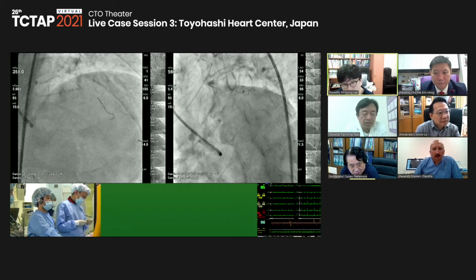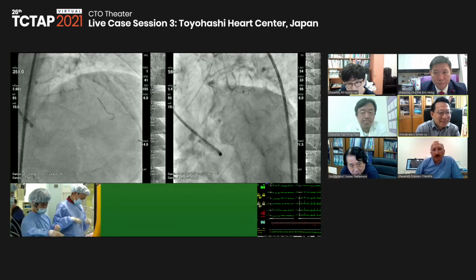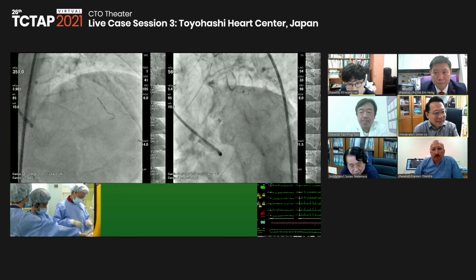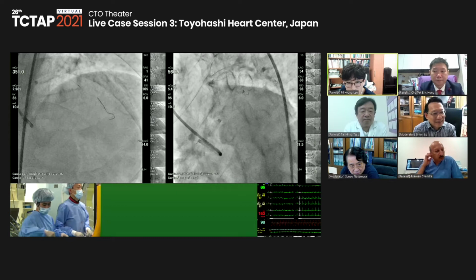Well, I suspect that the starting point of the micro channel is quite tricky. The angle is not favorable, so it will be quite hard to wire it. At least Dr. Nasu will do it, I think.